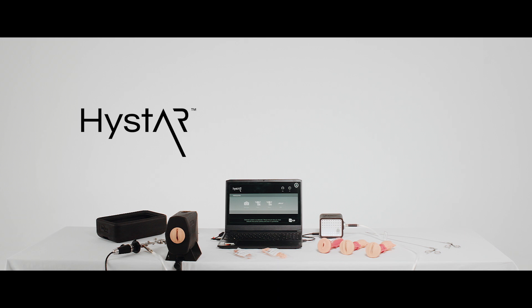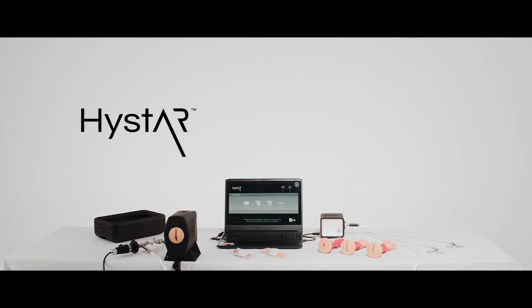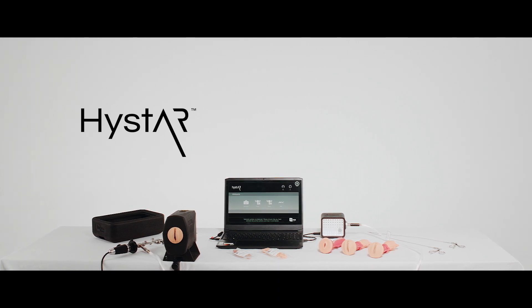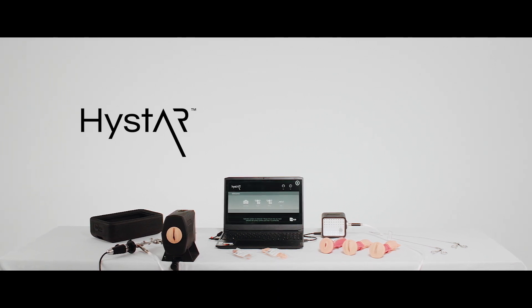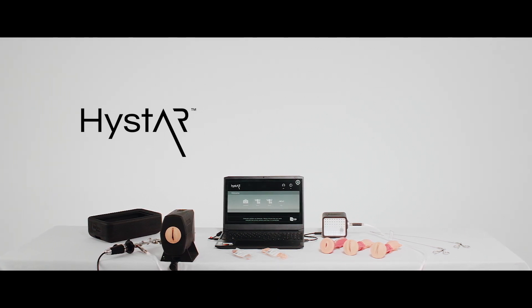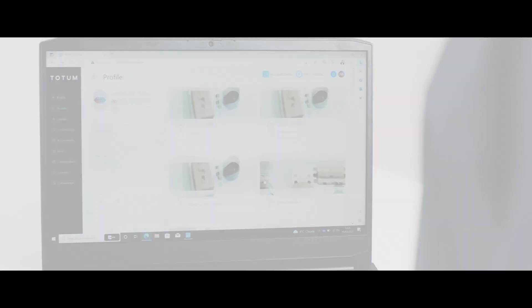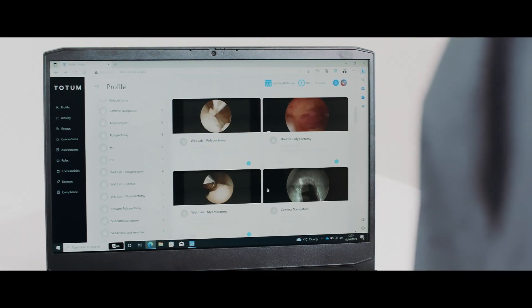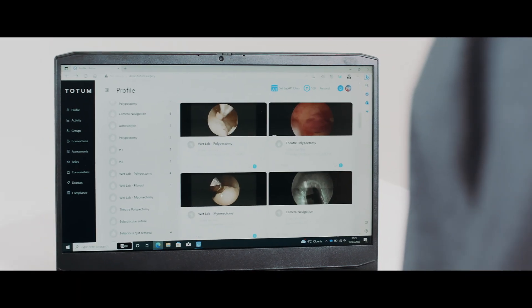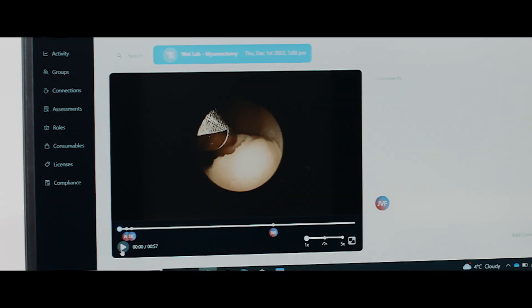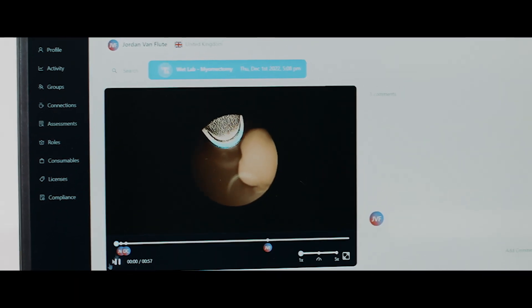The HystAR is our solution to democratizing high-fidelity hysteroscopy simulation training. Harnessing the power of TOTUM, the surgeon can use their laptop to power the HystAR package whilst capturing performance metrics and video to upload to their profile.